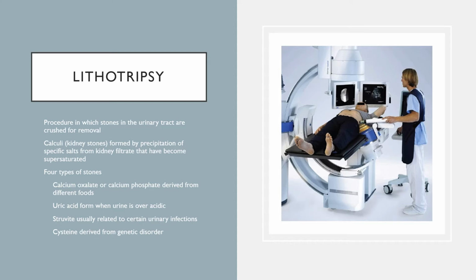Okay, and that is what we are seeing here in this image. So you can see our patient is usually awake or lightly sedated. We are going to keep them covered and comfortable. That is the main role of a surgical technologist in these cases, unless they are going to sleep and having a cystoscopy done as well.